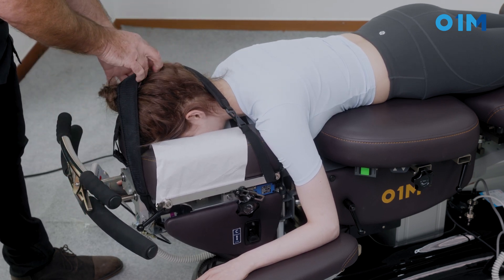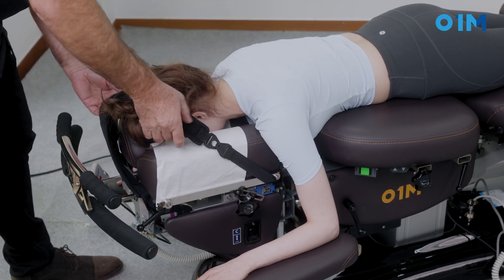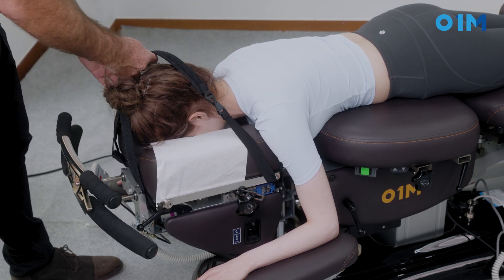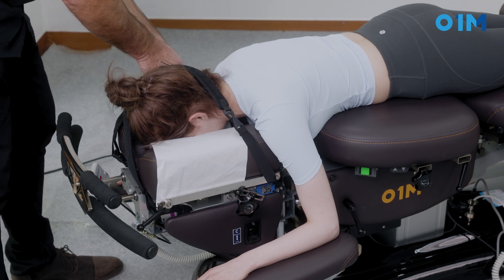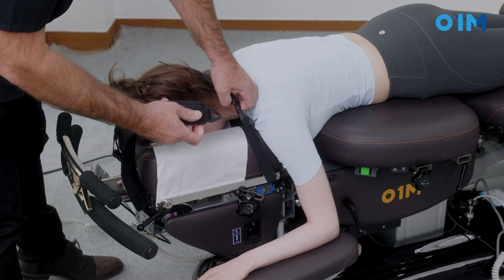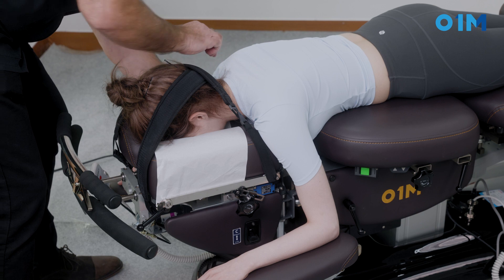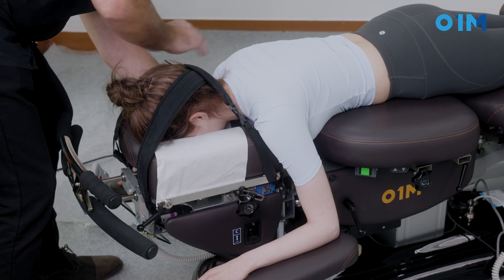Now I made a mistake. The mistake I made is I didn't use the Velcro in the right location. You have to be careful — the Velcro should be positioned in such a way that it grips. I had one Velcro at the wrong position right here, and this can happen quite often.